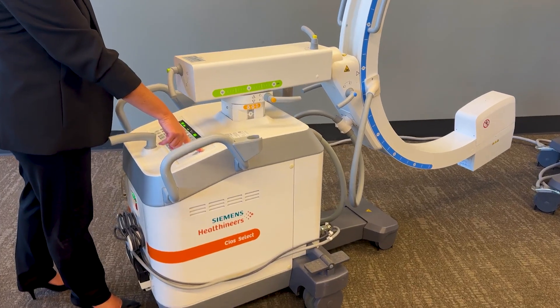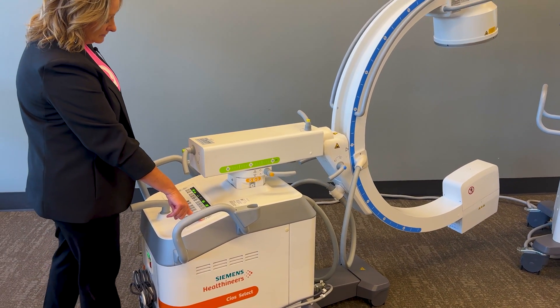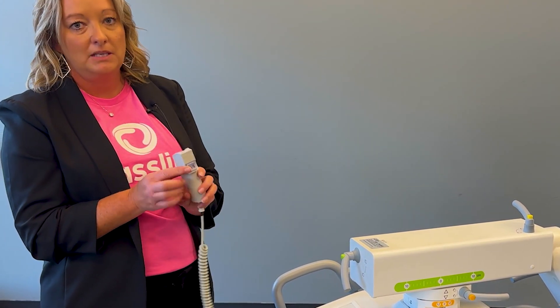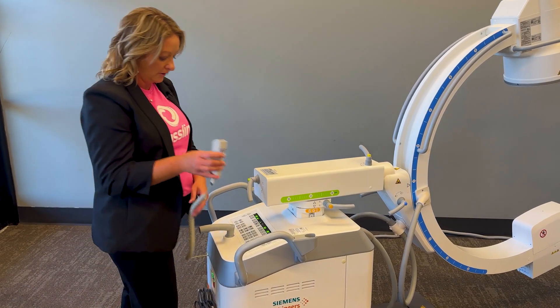Motorized up and down movements, and a hand switch for your exposure. There is an automatic save button right here — one click saves one image, or you can record a Cine Loop and store that Cine Loop by holding your save button a little bit longer.